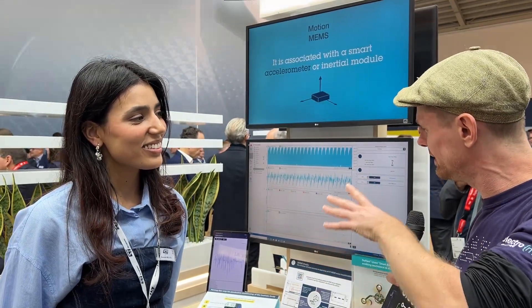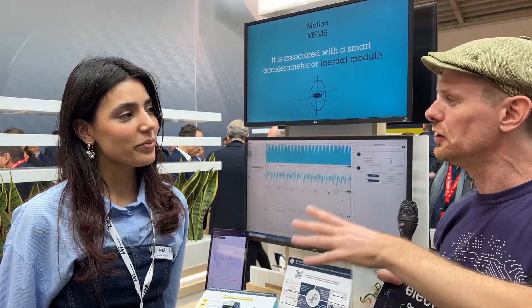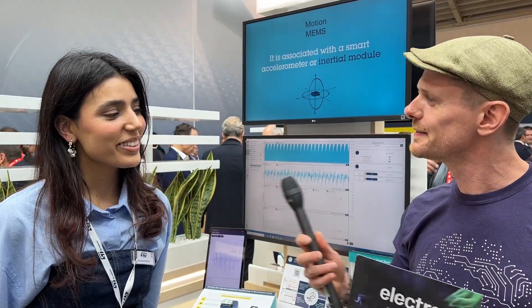So Asma, what have you brought here today? What is this demo about and how does the new MotionMems tech fit into it? So first, thank you for the introduction. Today we are presenting the biosensors, which is a new family of products addressing applications in healthcare, fitness, and wellness as well.